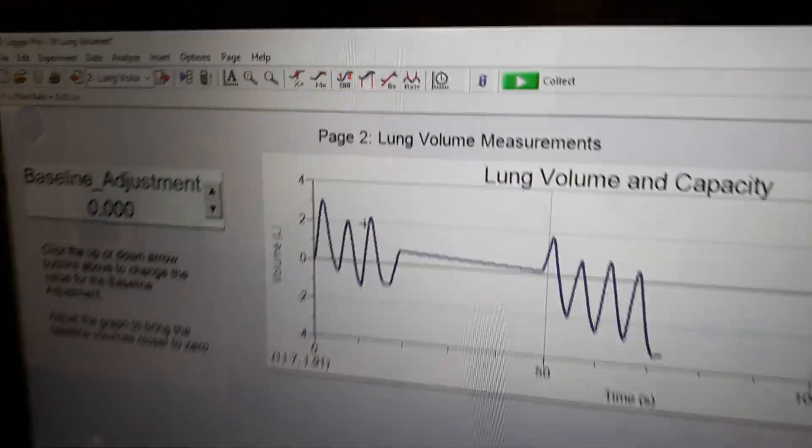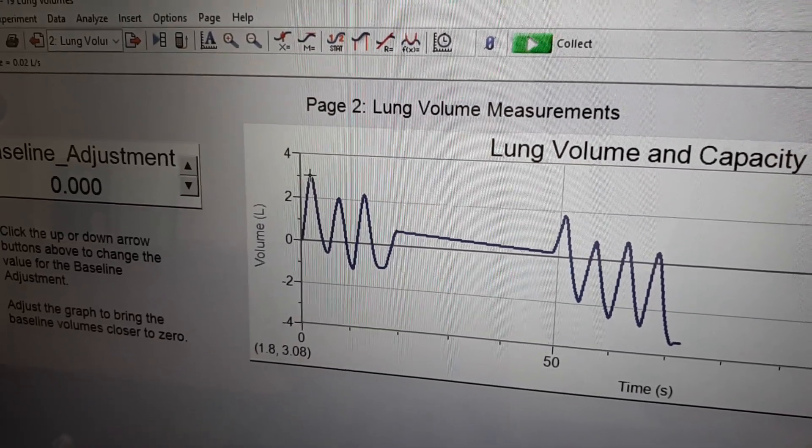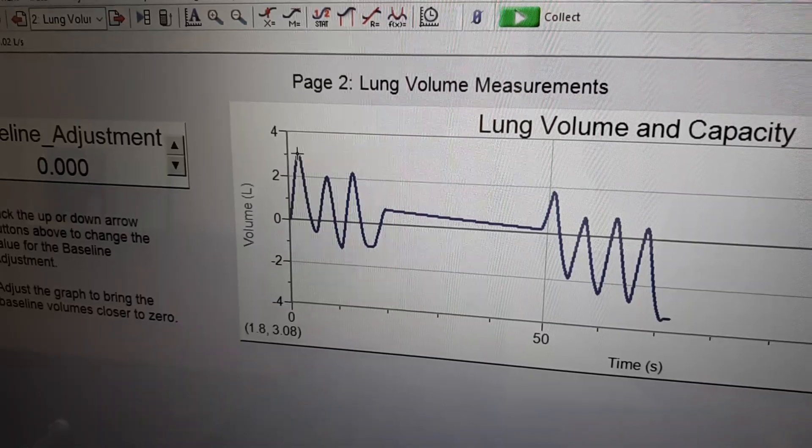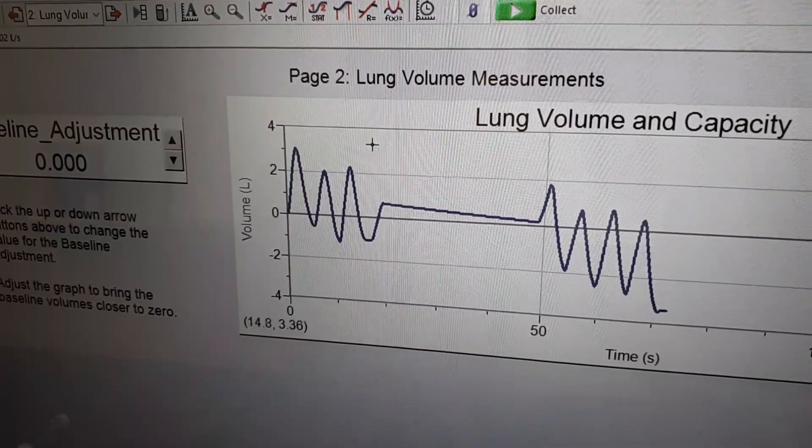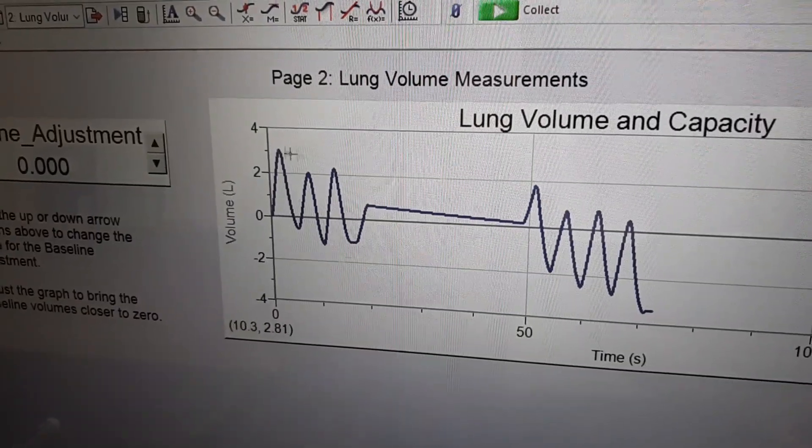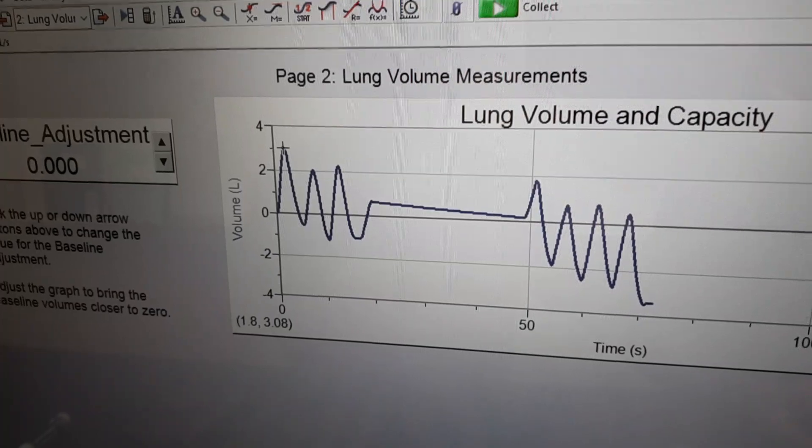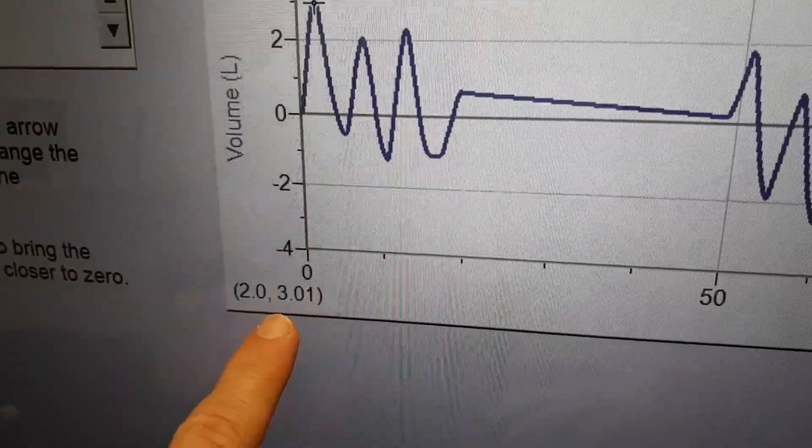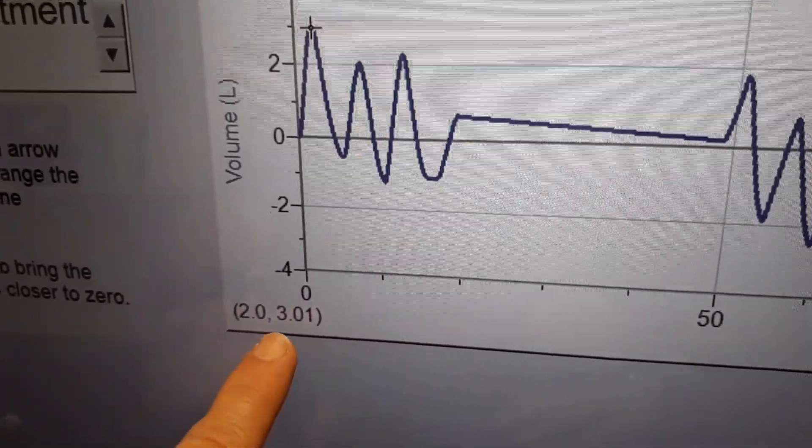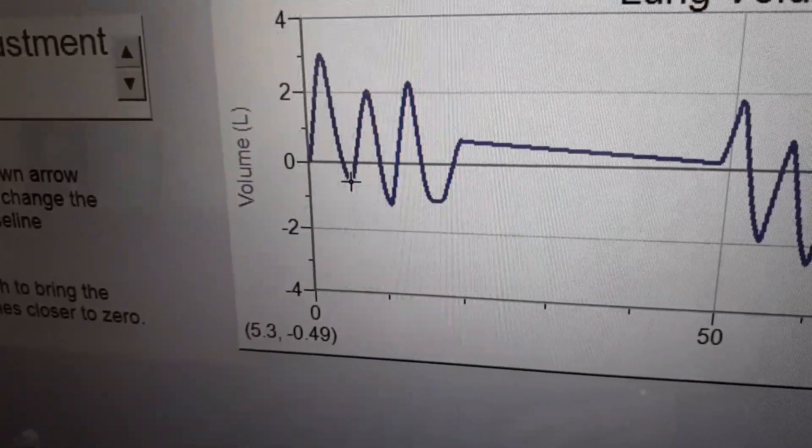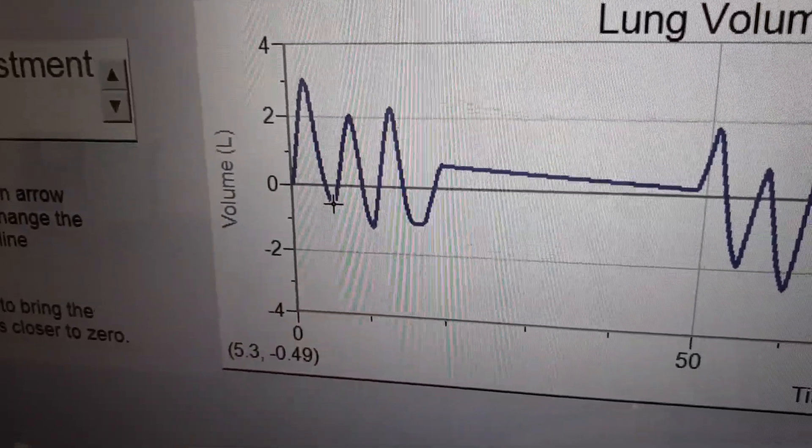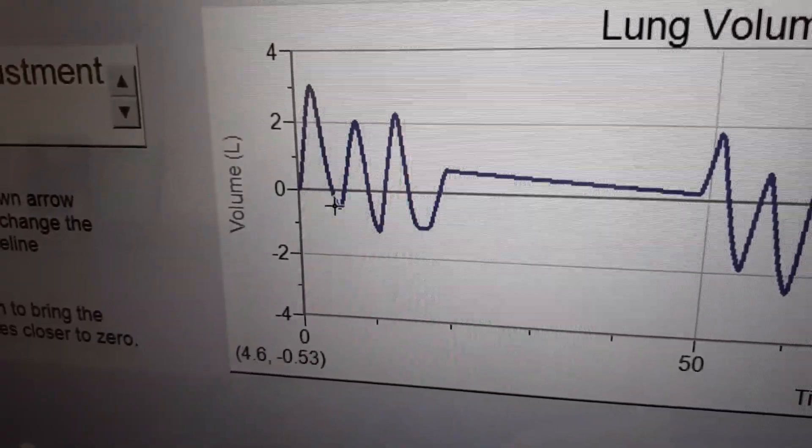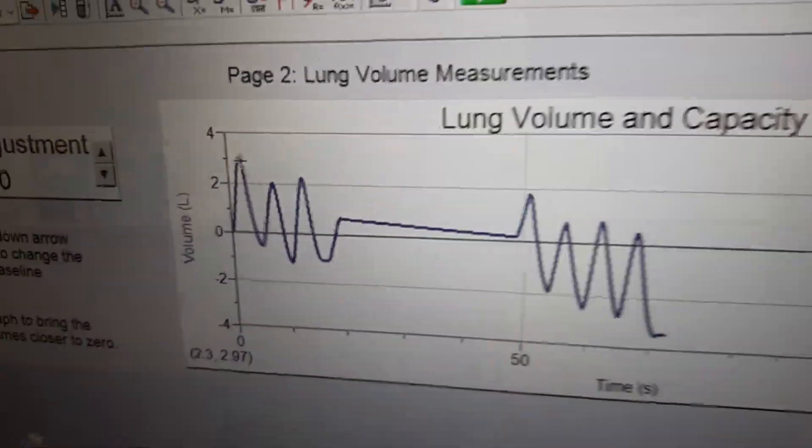If you look on your data sheet, you're going to have a couple of columns and rows that you need to fill out and fill in some of the boxes there. They're going to be before questions, so before you hold your breath and then after you hold your breath questions. You're going to want to get your volumes so what you can do is you can just put the mouse on your peak here if you want and if you look down here we've got a volume of 3.01 so you'll record that and then if you go down here you've got a valley of negative 0.49 and so you'll record that and then what you'll do is you'll take the difference between them and that's going to give you your total volume here.